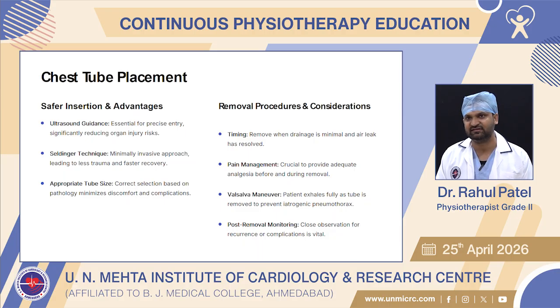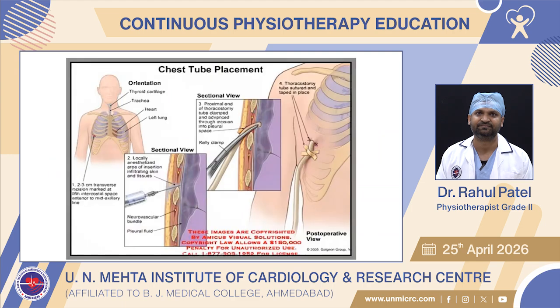Removal procedure and considerations. Timing: remove when drainage is minimal and the air leak has resolved. Pain management is crucial: provide adequate analgesia before and during removal. Valsalva maneuver: the patient exhales fully as the tube is removed to prevent iatrogenic pneumothorax. Post-removal monitoring: close observation for recurrence or complications is vital.